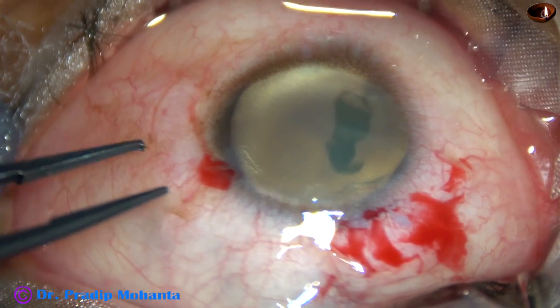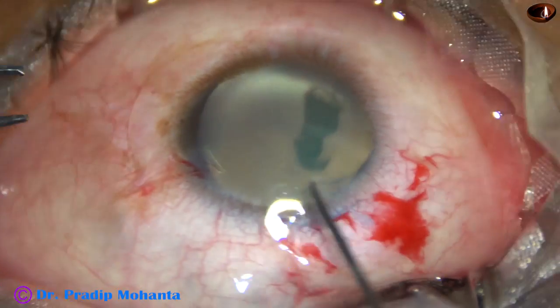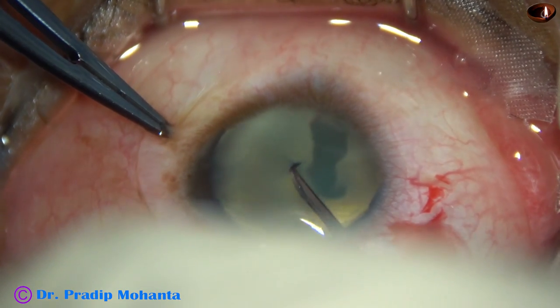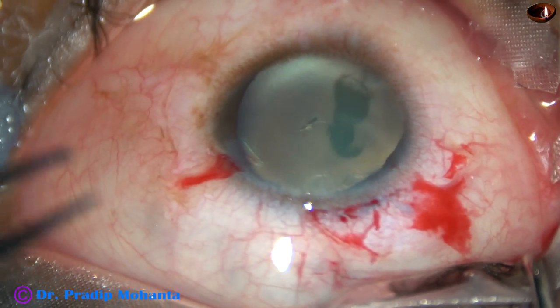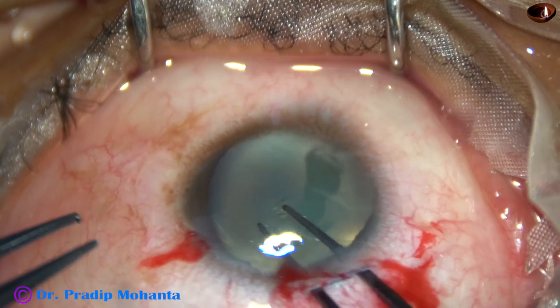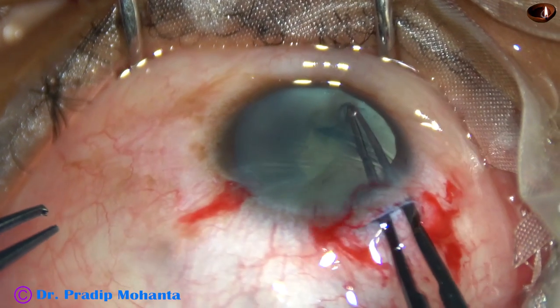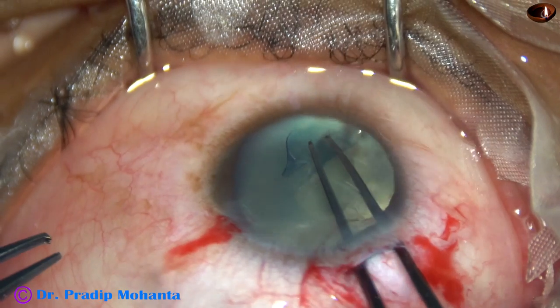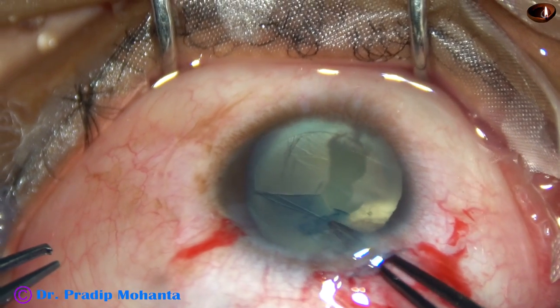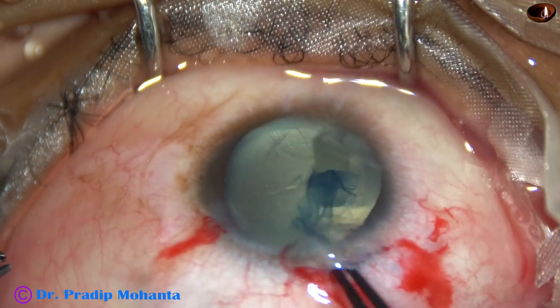You cannot see the iris. The pupil has dilated very well. Now capsulorhexis is to be done. I introduce a 26-gauge bent needle through the main wound, make a small incision on the anterior capsule and raise a capsular tag. I am making a small rhexis, about 5 mm. The corneal diameter is only 7 mm, and I am going almost near the corneoscleral junction to get an adequately sized rhexis.